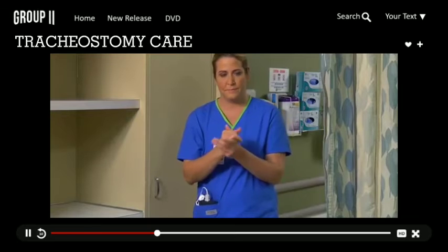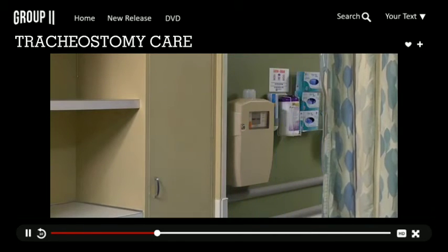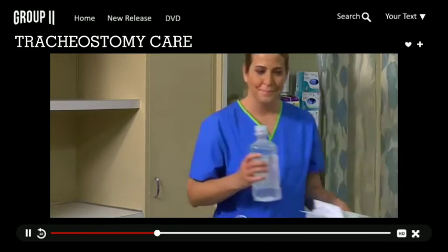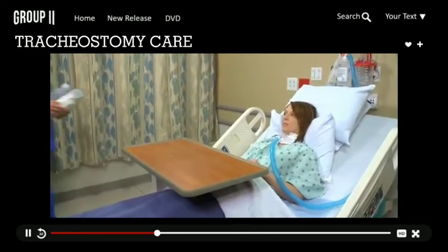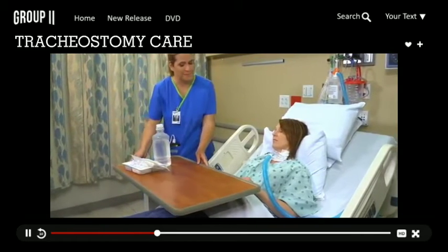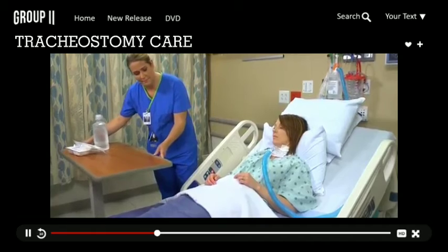Before providing tracheostomy care, ensure privacy, perform hand hygiene. Gather your supplies and introduce yourself to the patient. Good morning. My name's Erin. I'll be the nurse taking care of you today. Then identify her using 2 identifiers.